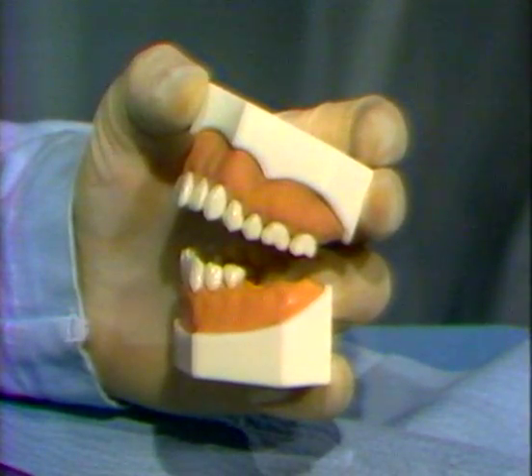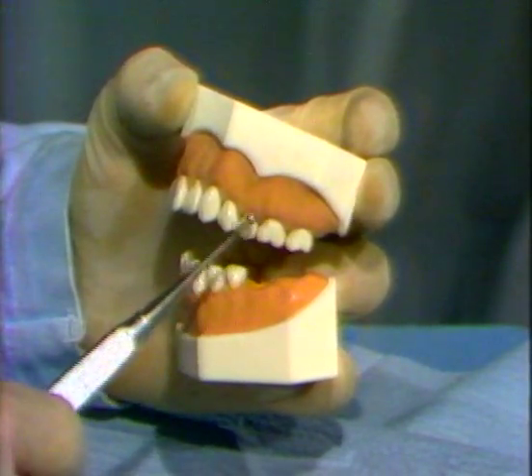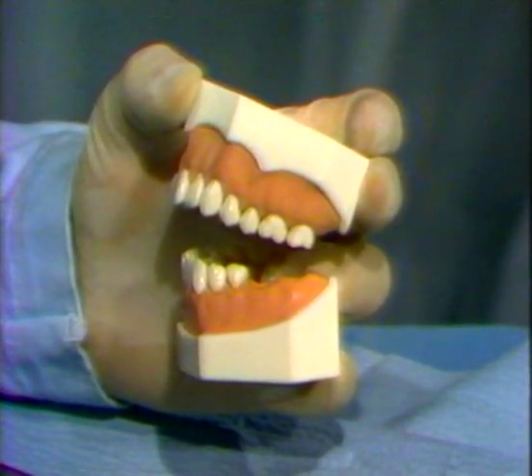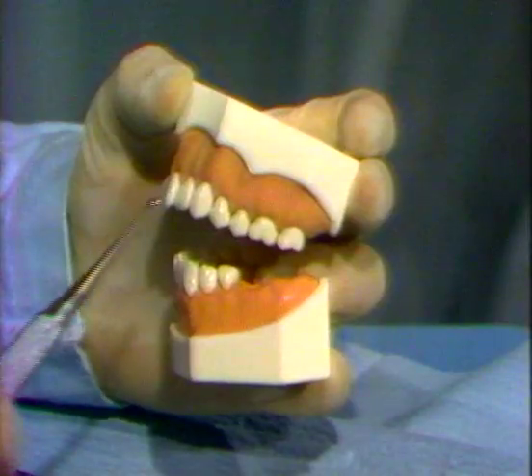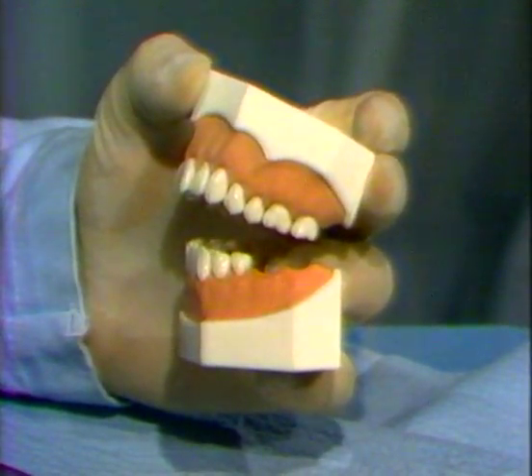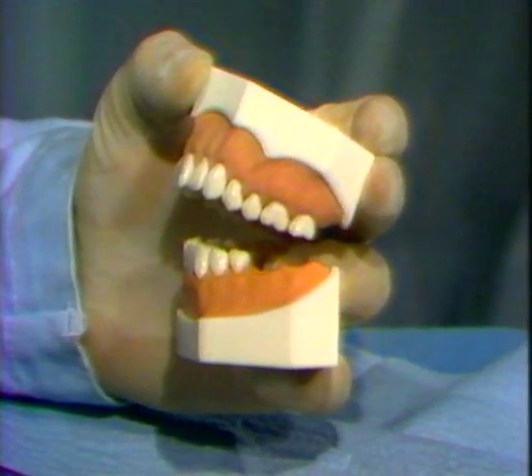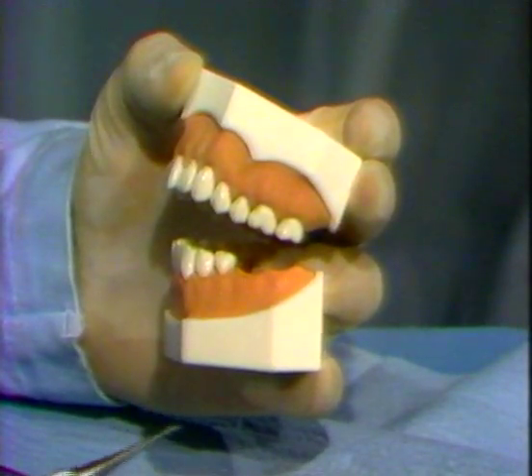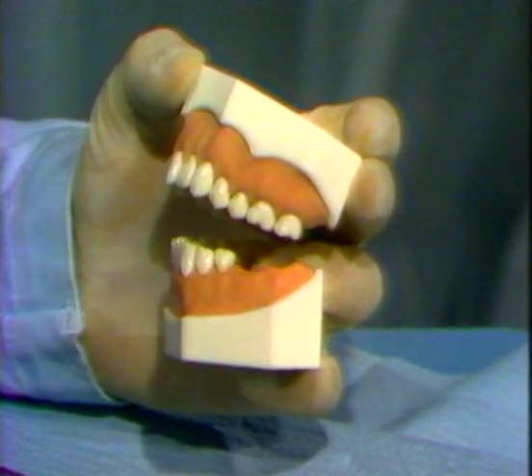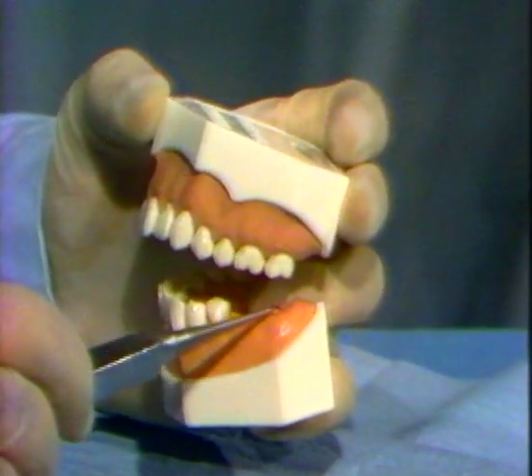When undertaking multiple extractions, it is best to start with the posterior teeth and work toward the anterior portion of the mouth. It is also advisable, when extracting maxillary and mandibular teeth, to extract maxillary teeth prior to mandibular teeth. Hemorrhage tends to accumulate in the posterior region of the mouth. If you begin in the anterior region, this may obscure the surgical field in the posterior region. Secondly, extracting maxillary teeth first prevents debris such as sections of fillings falling into mandibular sockets.